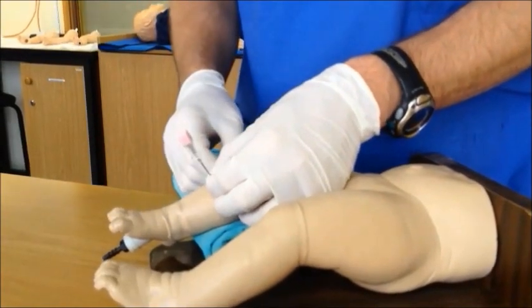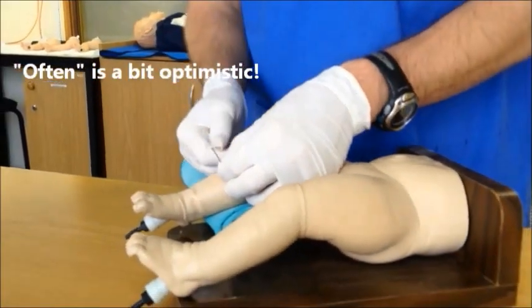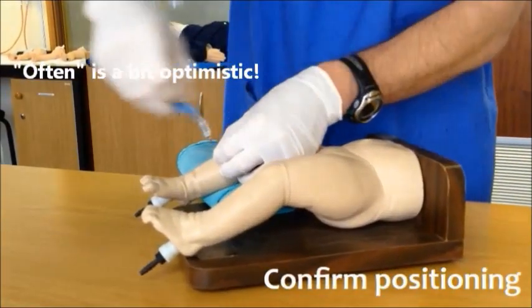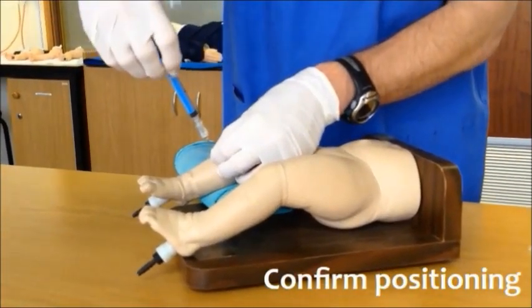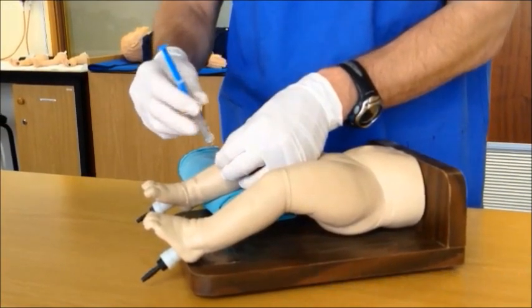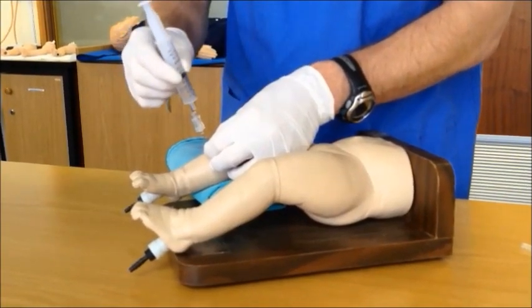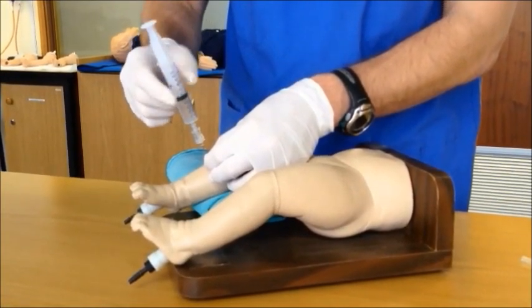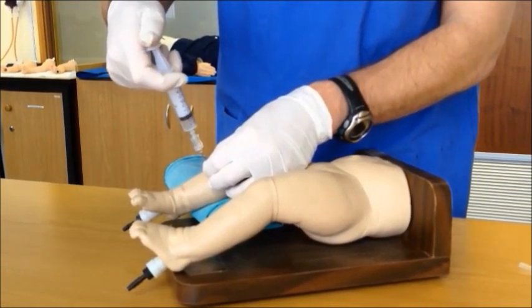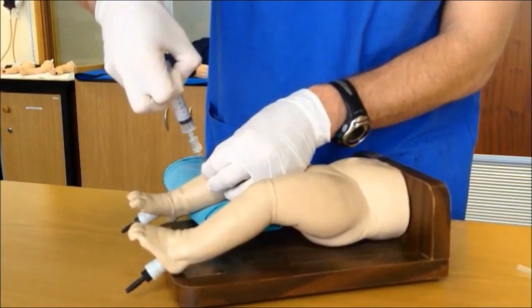Firmly grasp the needle, secure it to the skin, and remove the stylet. You will often have spontaneous flush of blood into the needle at this time. If not, attach a syringe to the end and aspirate to see if you can see any blood coming back. Another way to confirm position is to take a pre-filled saline syringe and attach it to the back of the needle. Infuse the fluid into the marrow space. Please note that there should be more resistance felt than with standard vascular access, but excessive force should not be necessary.